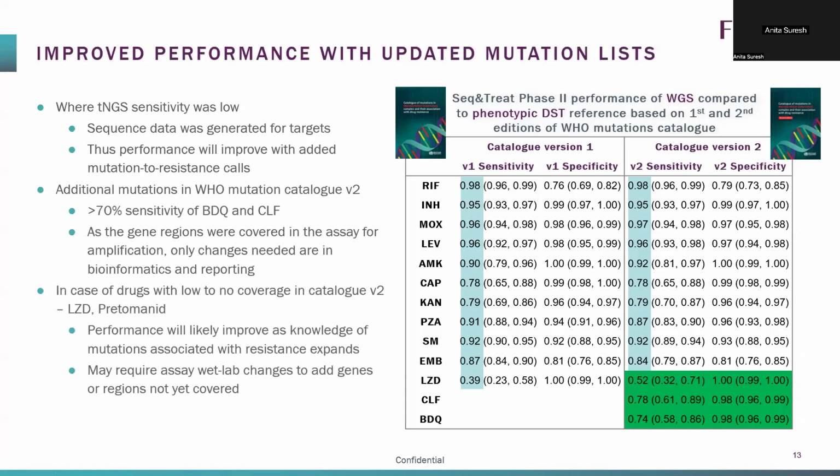As long as products have these regions amplified in their PCR, all they need to do is report on it, because those regions were already sequenced.